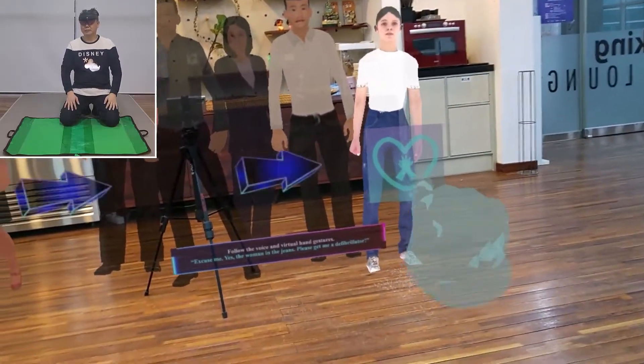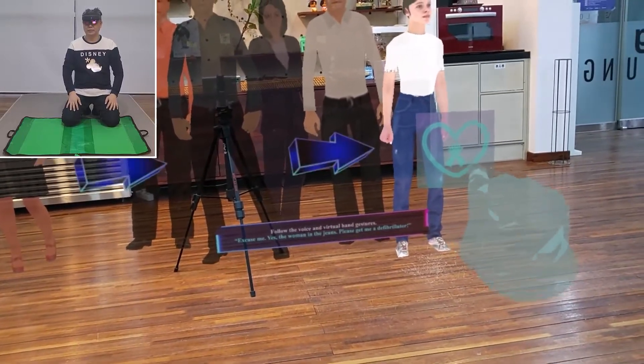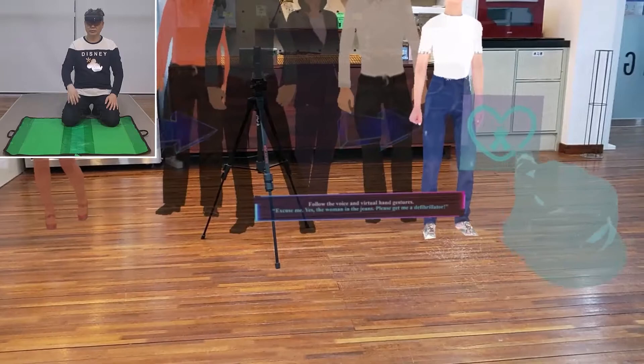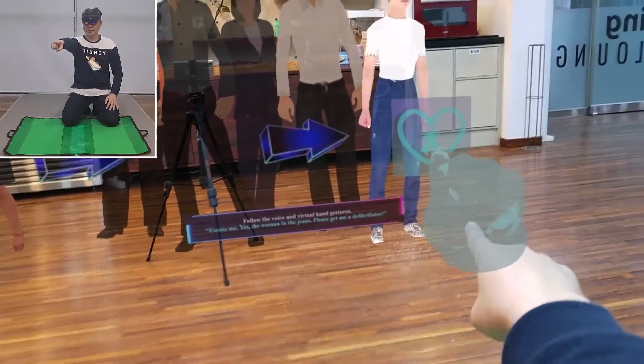Follow the voice and virtual hand gestures. Excuse me — yes, the woman in the jeans — please get me a defibrillator.